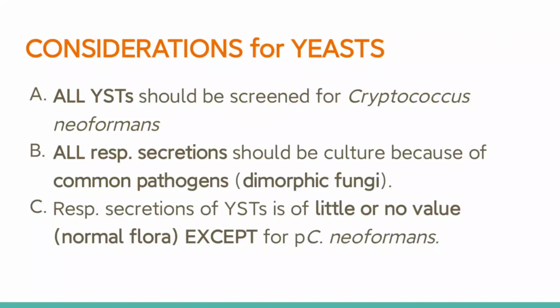So, ano ba yung mga screening tests natin for Cryptococcus neoformans? Number 1, we have the India ink or yung Nigrosin ink, no? As well as yung CALAS or yung antigen test nila, no? Yung Cryptococcal Antigen Latex Agglutination System.